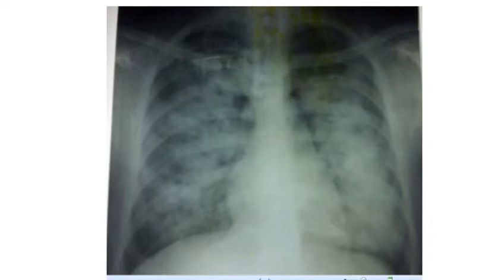Okay, yes. So there is a valve seen. So that is a mitral valve most probably. So if there is a valve and there is pulmonary edema, what is your diagnosis? Mitral stenosis. Prosthetic valve is there. And prosthetic valve dysfunction. What type of a dysfunction?